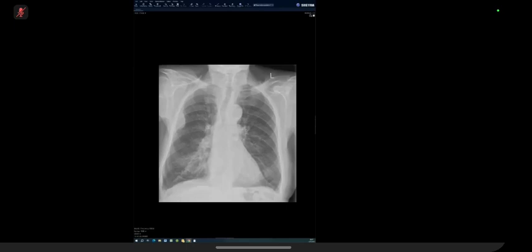It's moving too quickly. For the sarcoidosis case, silicosis and coal worker can also cause lymph node calcification. Was it the posterior predominance that made sarcoidosis more likely? Yes, absolutely. It was a typical appearance. In coal workers' pneumoconiosis, you tend to get lung calcification as well. That's something sarcoidosis does not tend to do. The nodules you get in pulmonary sarcoidosis, they don't tend to calcify.